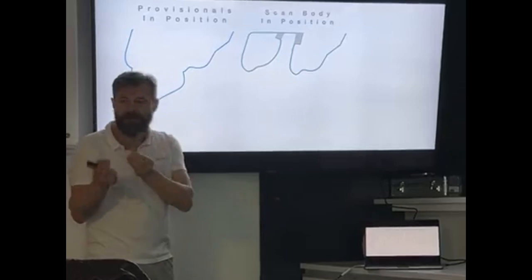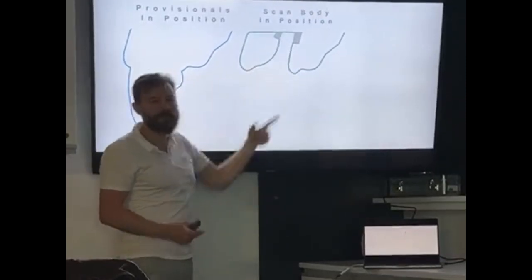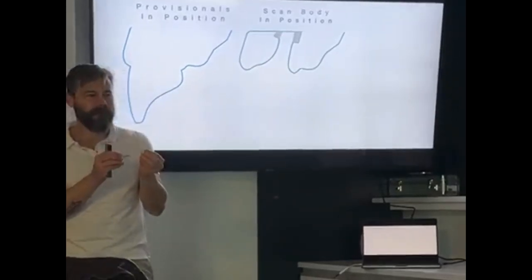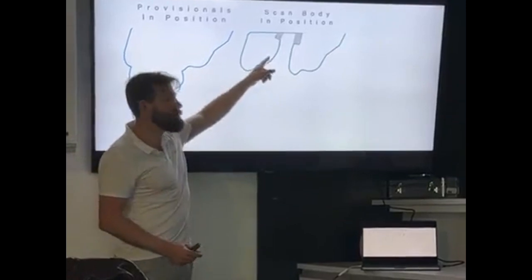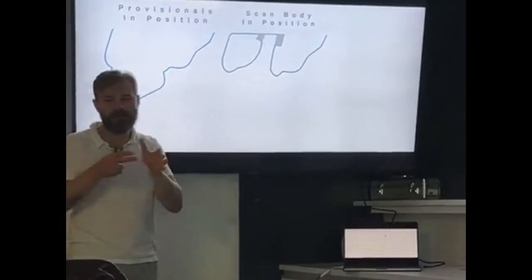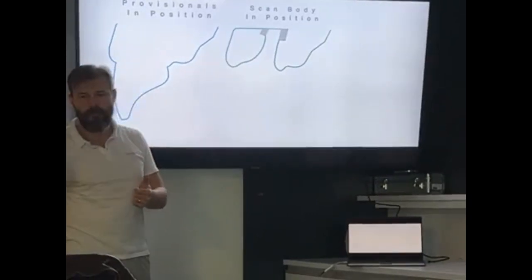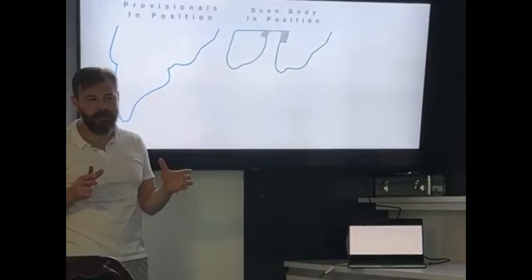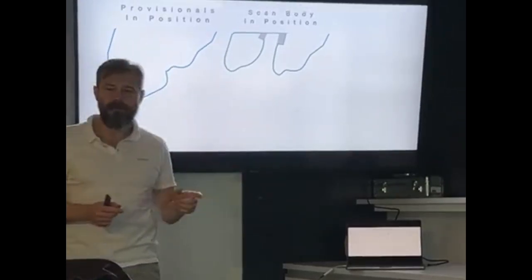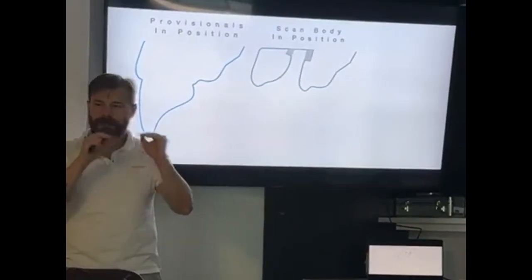The weak point about this scanning is the subgingival contour here on the socket. There you have distortion. If you have distortion in this image here, your new crown, your new abutment is not going to fit in the place. It's going to be a gap, it's going to be over compression, and you're going to lose the control. You need to adapt it too much, adjust too much, send back to the lab. What they want is to receive a job that is really precise.